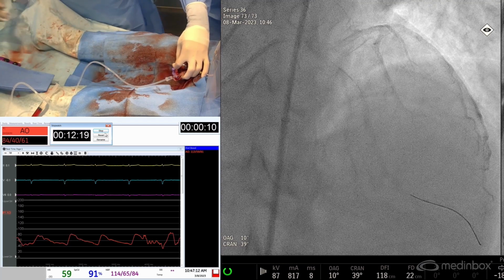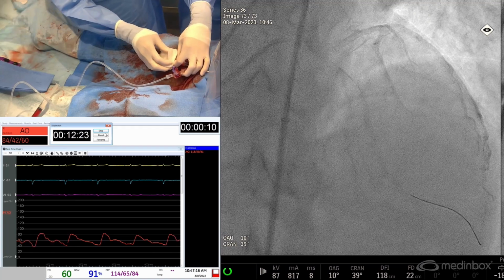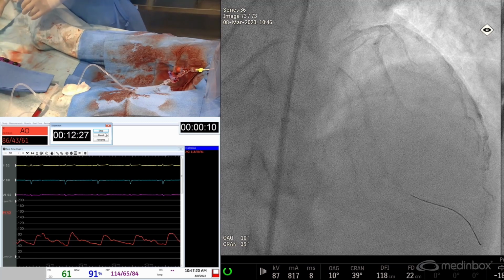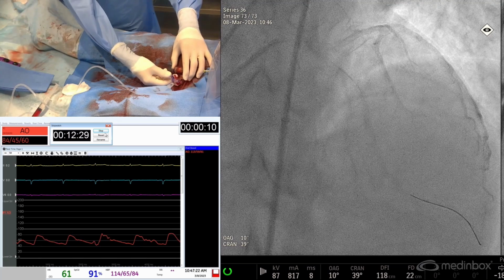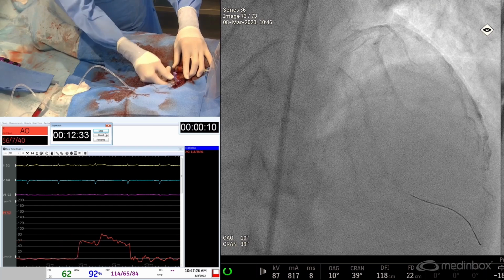Neo 2. Pressure is a bit more on the lower end. There's a bit of a gap between our actual pressure cuffs, as you can see, versus our pressure monitor.